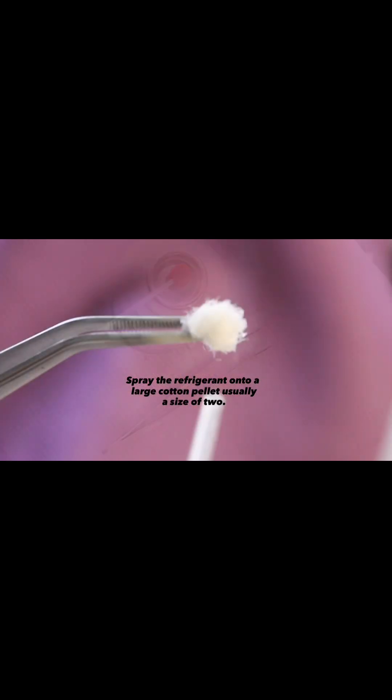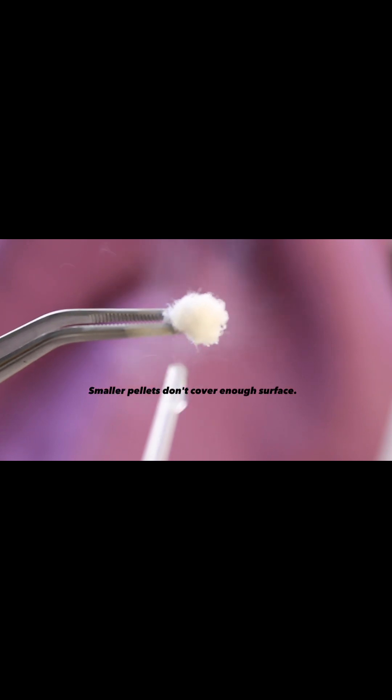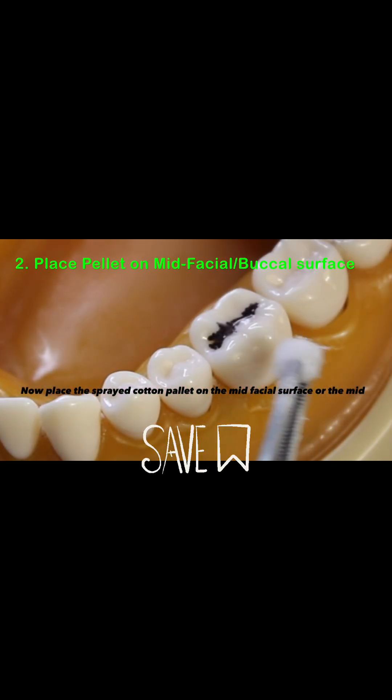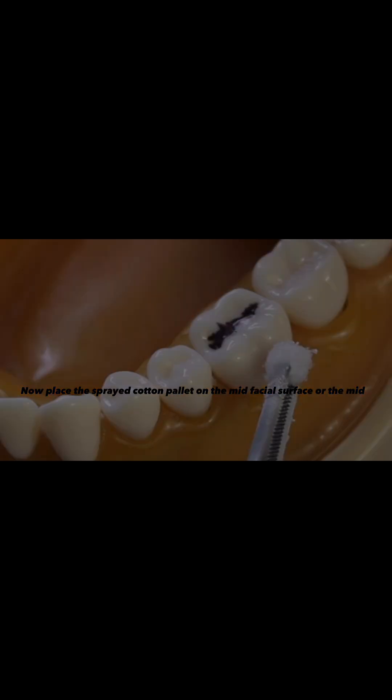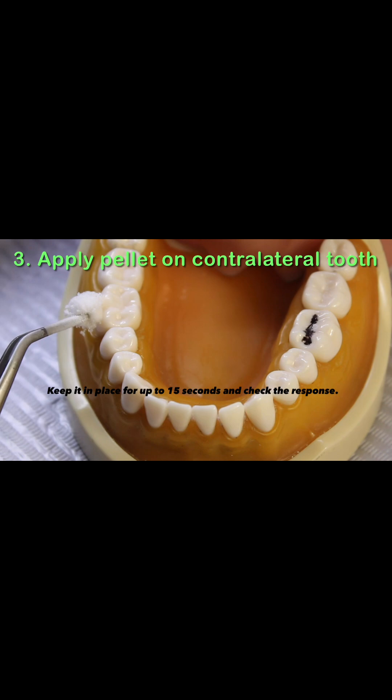How to perform a cold test? Spray the refrigerant onto a large cotton pellet, usually a size 2. Smaller pellets don't cover enough surface. Now place the sprayed cotton pellet on the mid-facial surface or the mid-buccal surface of the tooth. Keep it in place for up to 15 seconds and check the response.